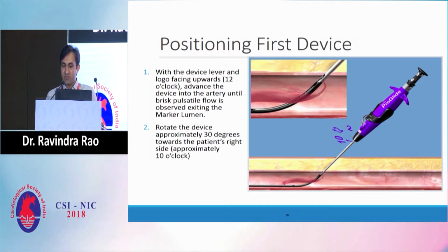And with maintaining the pull, then you push your plunger down. This is the plunger. Once you push the plunger down, the needles pierce the anterior wall, and then you pull it out and you cut the suture. Suture has got a blue and a white end. You cut on the blue end, then you open the foot plate and this comes out.